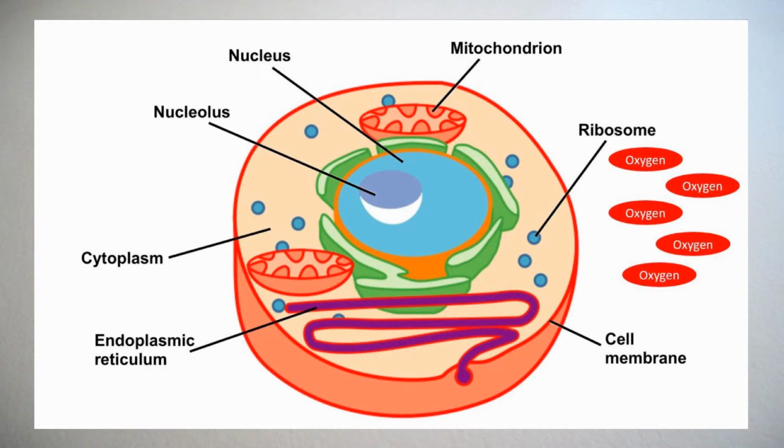In today's Medic Minute, we will discuss the use of end-tidal CO2 as a way to recognize sepsis in our sick patients. Now, for our patient that we suspect may be heading towards sepsis, their cells, which normally use oxygen as energy, which we often refer to as aerobic cellular respiration, start to see a decrease in available oxygen due to the underlying illness. This in turn causes our cells to switch to anaerobic cellular respiration. During this anaerobic process, pyruvate within our cells creates energy without oxygen, which gives off a byproduct into our bloodstream called lactate. As this lactate builds up within the body, this puts our patient into a state of metabolic acidosis.